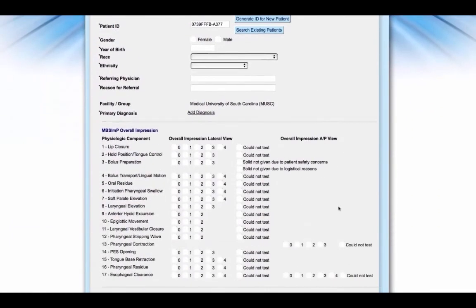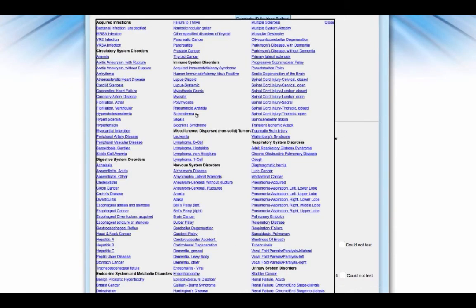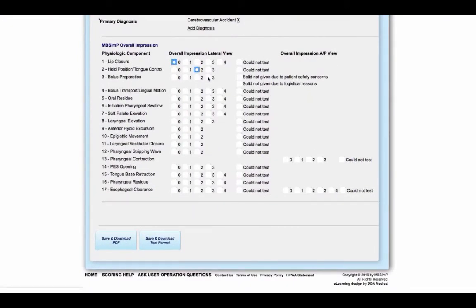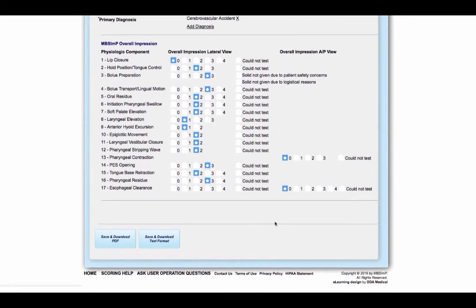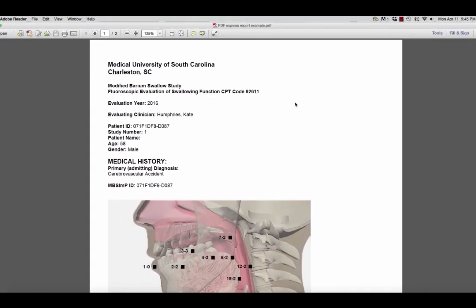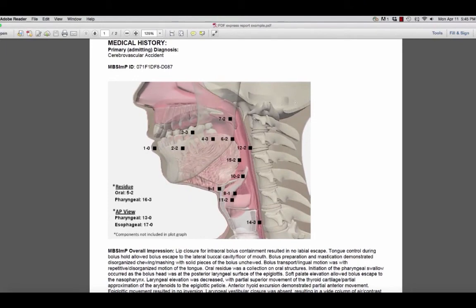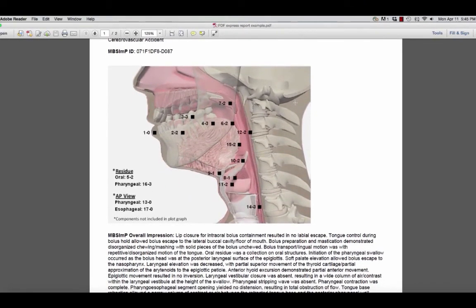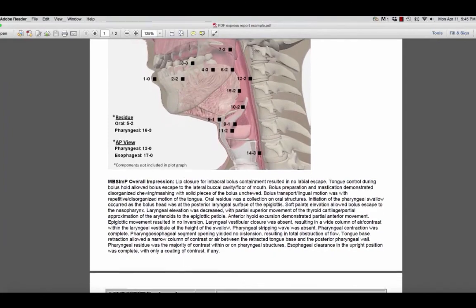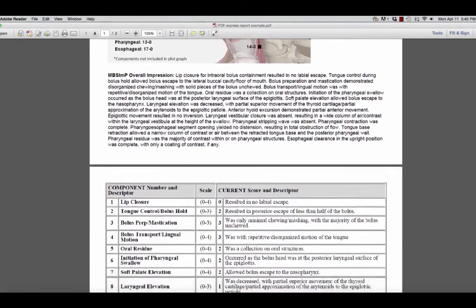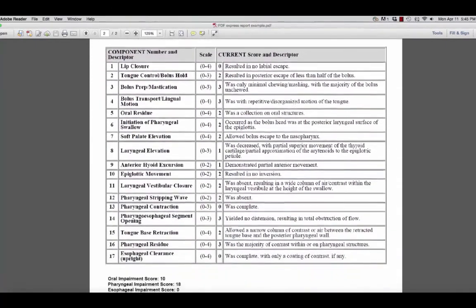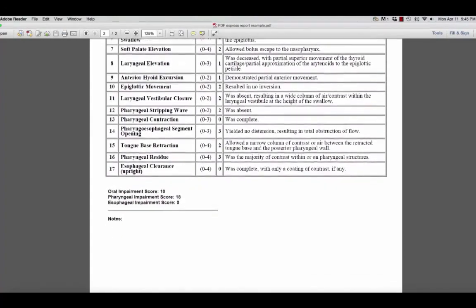Once an ID is obtained, the patient's year of birth, race, ethnicity, referring physician, reason for referral, primary medical diagnosis, and MBS-IMP overall impression scores must be entered before a report can be generated. There are two options for generating a report. The first is formatted as a PDF file that can be downloaded to your computer or tablet. Scrolling through the report, you will notice a plot graph image representing the location and severity of each of the 17 MBS-IMP physiologic components. The plot graph image is a feature of both the full and express report generators, derived directly from the information entered into the report and complements the descriptive table containing the MBS-IMP overall impression scores and nomenclature.